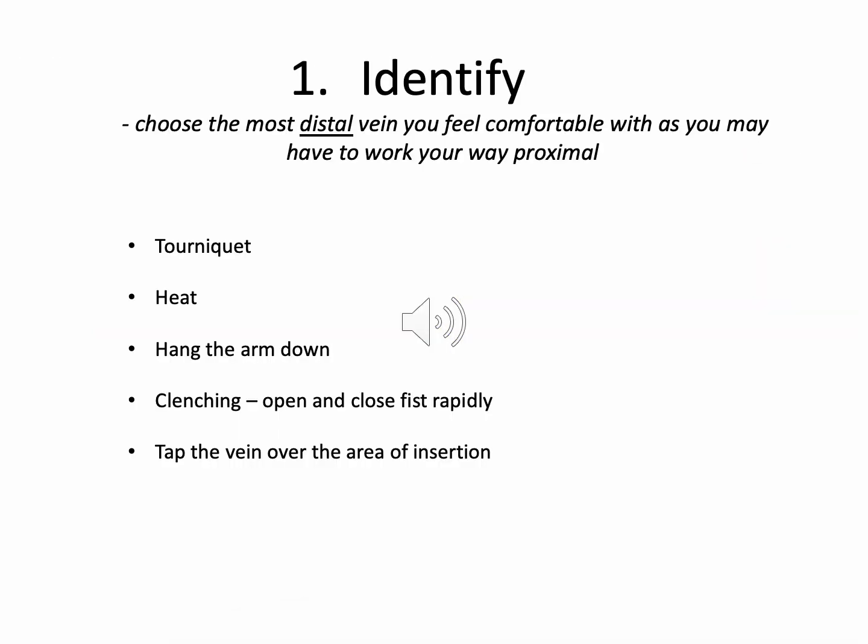There is not much to say on this slide other than that the body conserves heat by vasoconstricting superficial vessels in the skin. Those are the veins. So, cold veins are vasoconstricted veins, which will make your job of placing a cannula, especially in small thready veins, much more difficult.